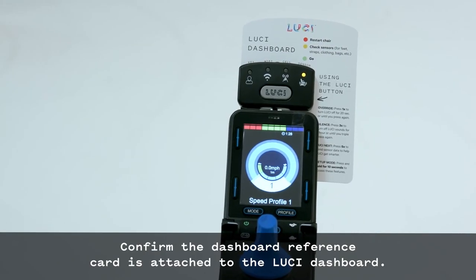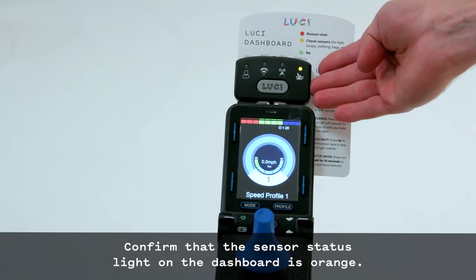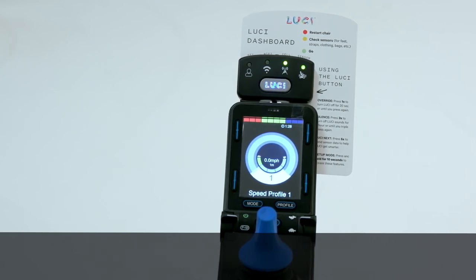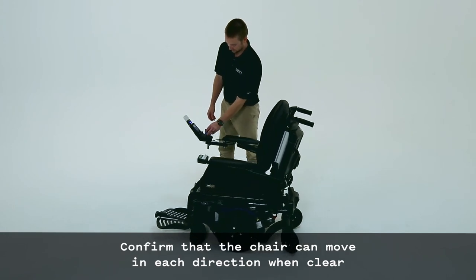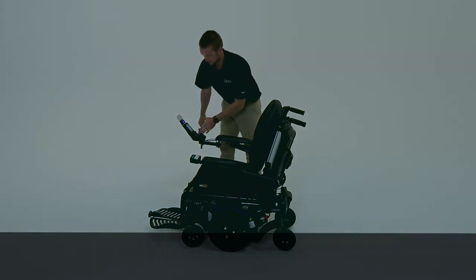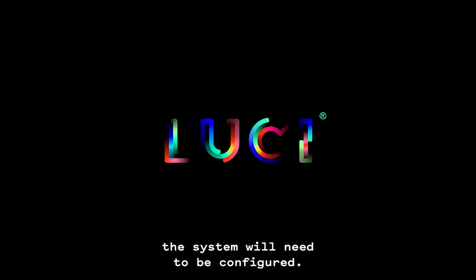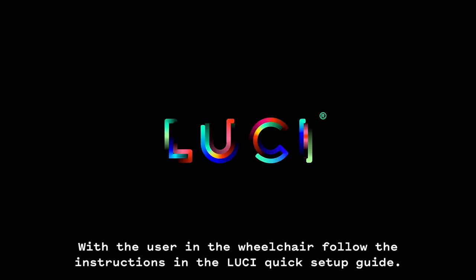Confirm the dashboard reference card is attached to the Lucy dashboard. Confirm that the sensor status light on the dashboard is orange. Press the Lucy button and make sure it lights up blue. Confirm that the chair can move in each direction when clear and that it stops in a blocked direction of travel. Congratulations — you've installed Lucy! Before releasing the wheelchair to the user, the system will need to be configured. With the user in the wheelchair, follow the instructions in the Lucy Quick Setup Guide.